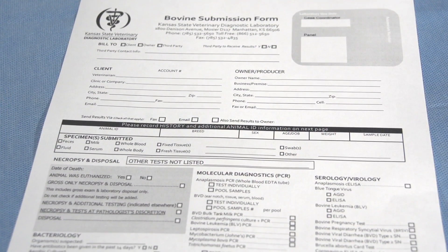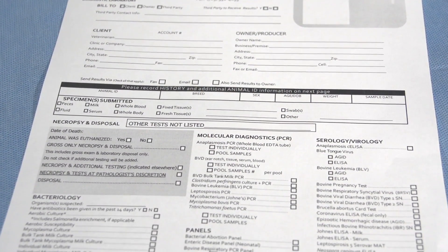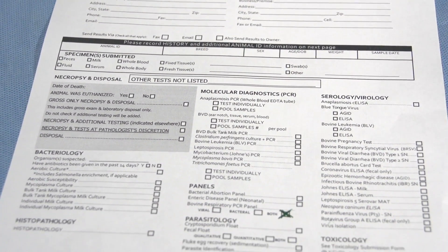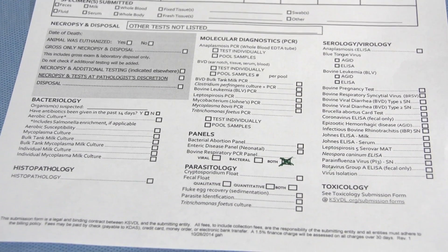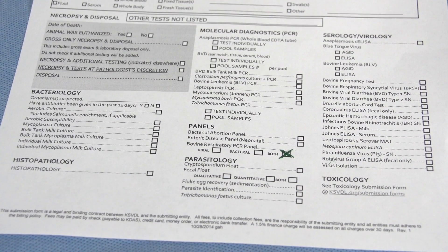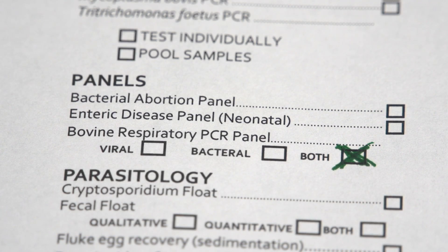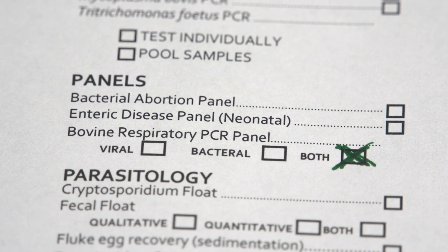It is important to mark the correct box on the bovine submission form. The request for PCR is located under panels. You can request viral, bacterial, or both.